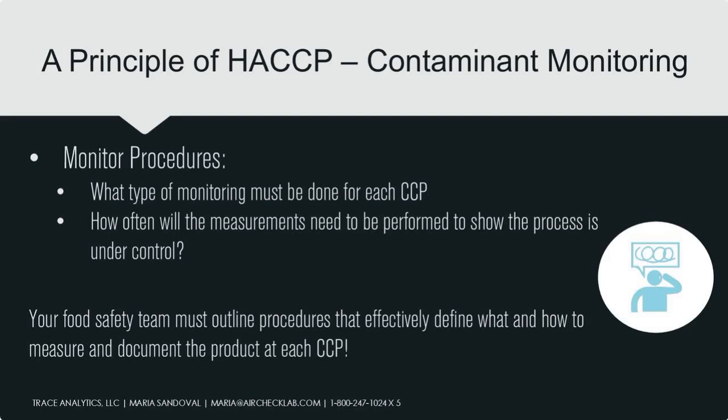And I just touched a little bit on some of the contaminants, but you need to be mindful of the contaminants. And there are a ton of classes that you can take to recognize what a critical control point should be. And when you do these types of HACCP analyses and risk assessments, you will learn based on what part of your facility you're in, how often you need to make these measurements, how often you need to be performing these monitoring tests. And I'm gonna say this a bunch of times during my talk, but you cannot be monitoring something that you're not testing.